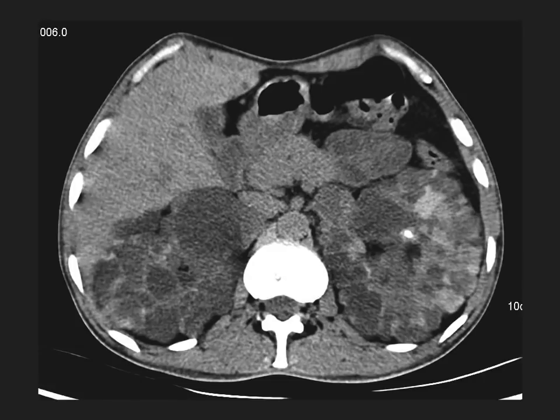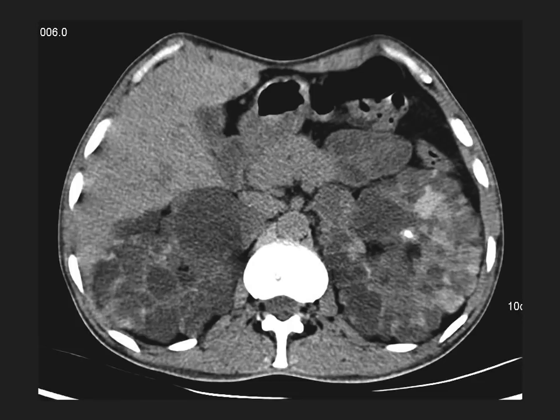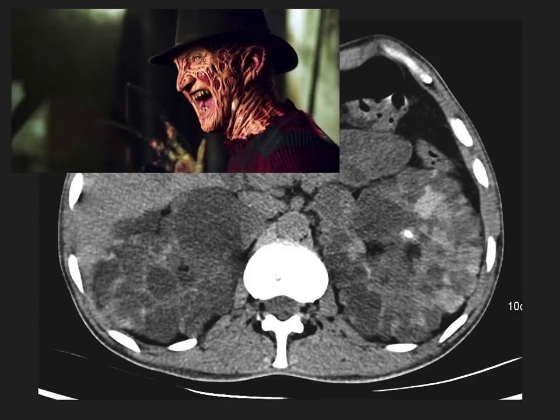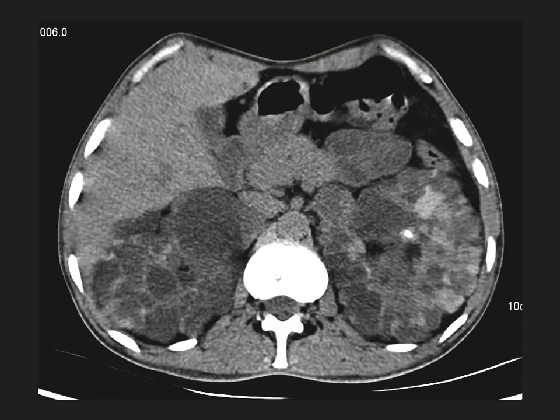Here's our first abnormal CT of the abdomen. What's going on here? Pause the video if you need more time. What we're seeing here are two massively enlarged cystic kidneys. You see them on the patient's posterior — you should see two massively dilated kidneys each filled with cysts. This is clearly polycystic kidney disease. These kidneys show massively enlarged kidneys bilaterally, filled with cysts, with mixed areas of hyper and hypodensity.